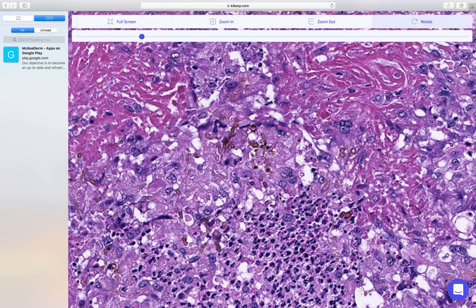Phialophora can produce different conditions under different circumstances: in some patients it produces this subcutaneous cyst, in others it can cause chromoblastomycosis, and in others it may cause mycetoma. The take-home message is: when you see suppurative granulomatous inflammation forming a cystic structure in the dermis, and you look carefully and find hyphae and yeast forms, then it's almost certainly pheohyphomycosis — final diagnosis depending on culture.